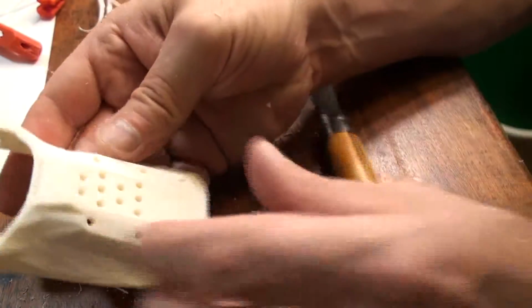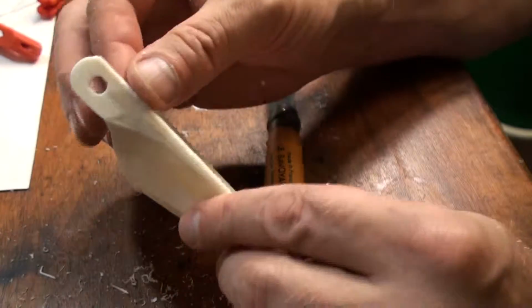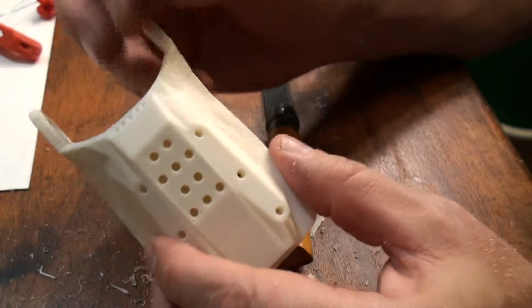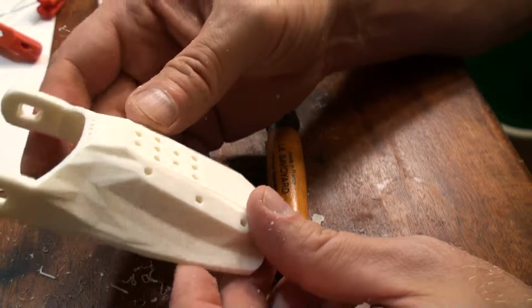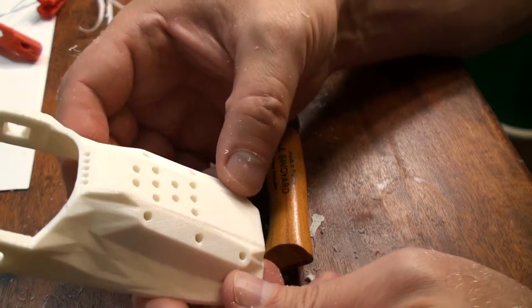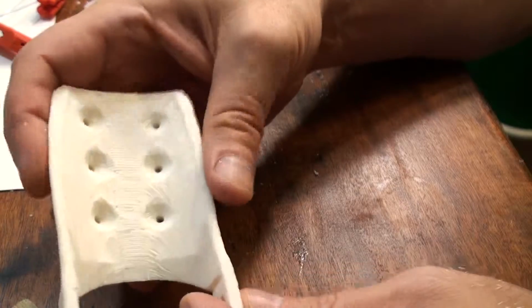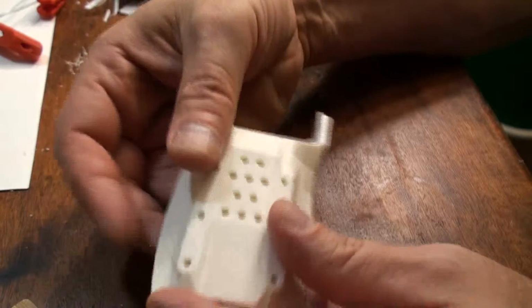All right. So that's pretty much all the support material removed, and now all this needs is we need to make these holes match up with the screws. The underside, when you finish the device, you won't see this at all. So looks pretty spiffy.